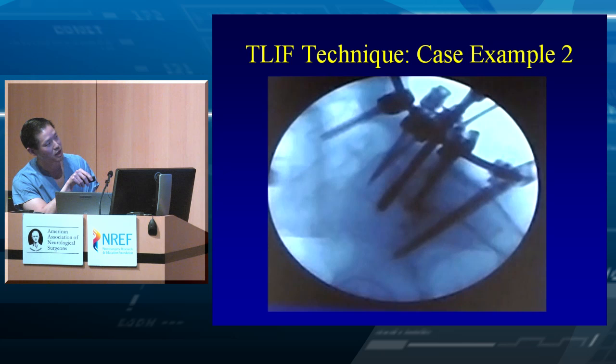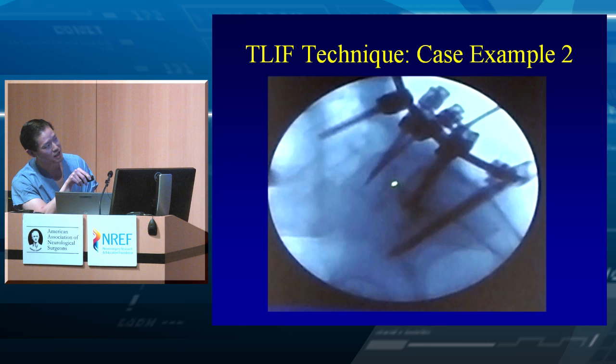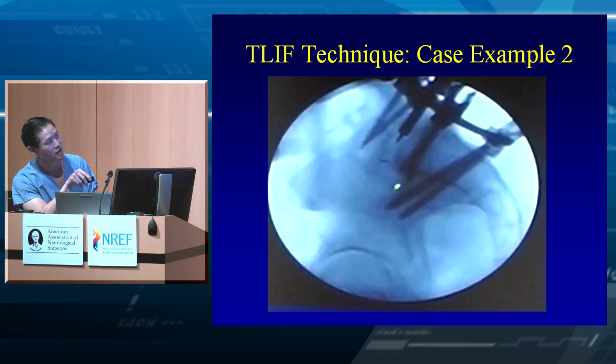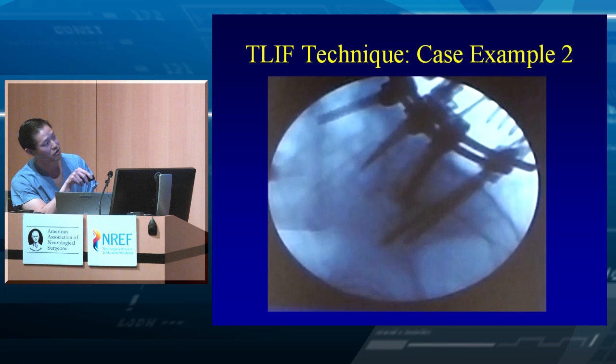And then that's decent, but you have the other side. I've already reduced off one side. This is a distracting osteotome that goes in because I'm trying to get a cage in, right? And so this ends up being a 6 millimeter cage that goes in, not that high, but enough to get a cage in. And then you can distract off the other end, and you end up with this as a final. It's mostly reduced now. You've improved the lumbosacral angle quite a bit.